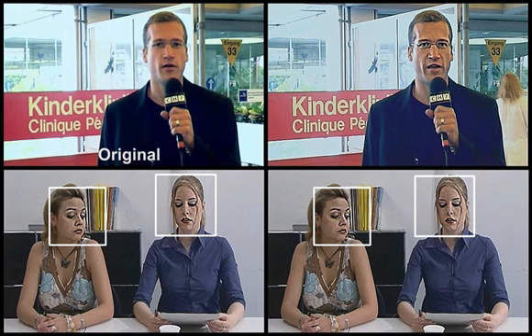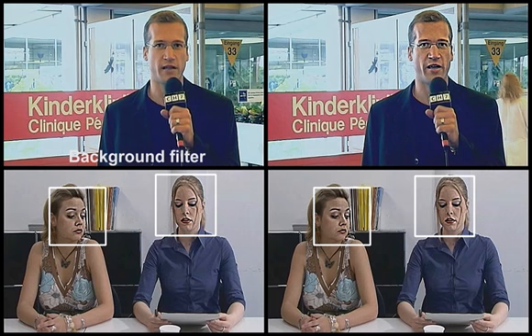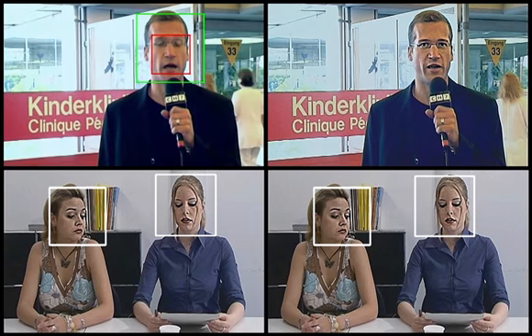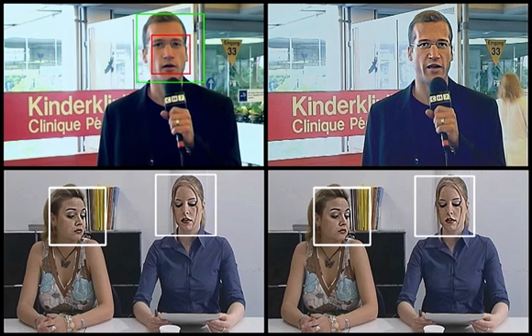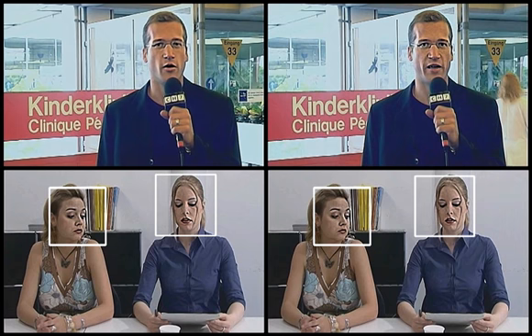The filtering method applies an adaptive contrast enhancement filter to compensate for the loss of contrast sensitivity. People with AMD prefer different filtering parameterization for background and face regions. Each video frame is segmented into facial and non-facial regions. Face regions are spatially extended in order to include chin and forehead. An alpha blending mask is used to dissolve face and background filtered regions seamlessly.